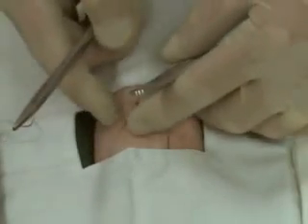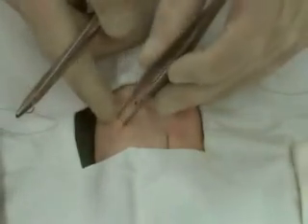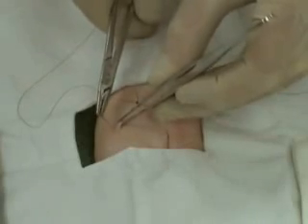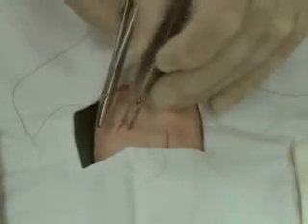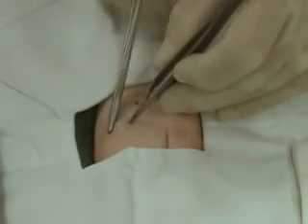Demonstrating the length of the incision, we're dividing in half to avoid dog ears. Place the needle at a 90-degree angle. Use your wrist to turn the needle through. Hold the end of the suture to not pull it through and leave a tail long enough for tying the suture. Place the instrument between the two sutures.